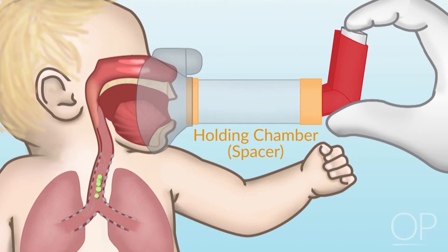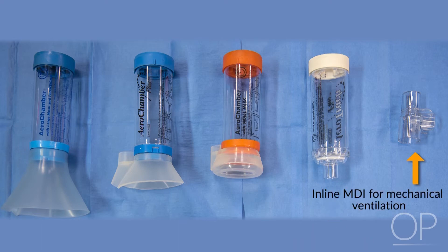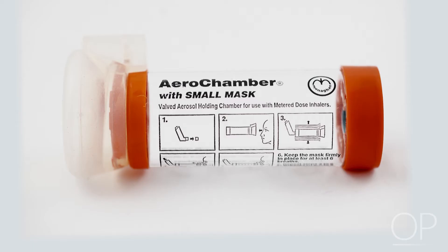We have several different interface options. Depending on the patient's size, we have different masks and different sized chambers. Additionally, we have spacers that are built for endotracheal and/or tracheostomy tubes. Also, we have inline MDIs, which can be used during mechanical ventilation. I have selected a pediatric sized chamber with an appropriate mask for this patient.